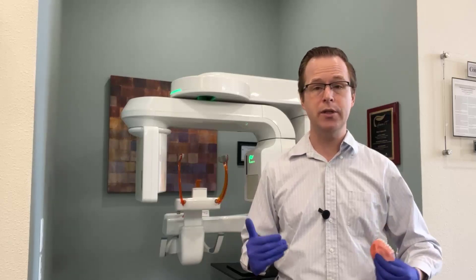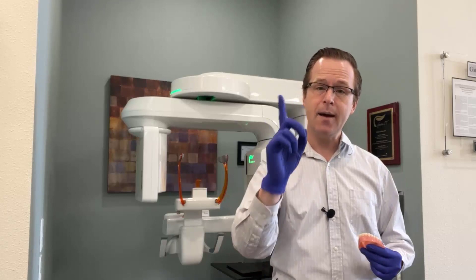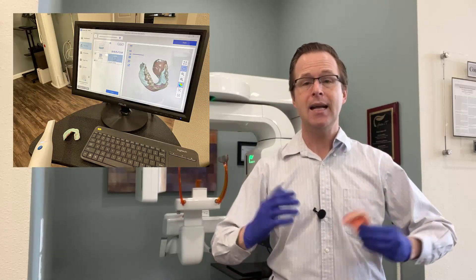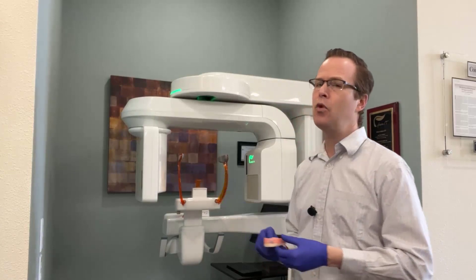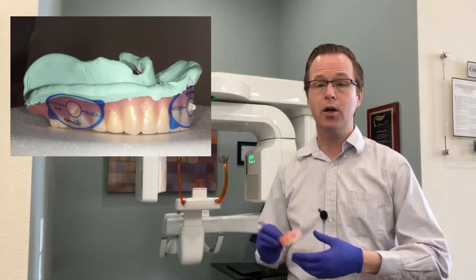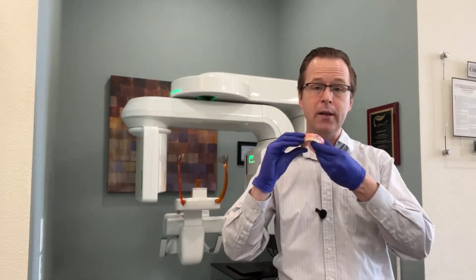If the patient moved during the scan, we may want to recreate it. You'll see double images or ghosting if the patient moves. We have to watch that because many of our overdenture patients tend to be older and have a little trouble standing still in the cone beam machine. Once we've captured scan number one — our cone beam scan of the patient wearing the prosthesis — we can remove the prosthesis, have the patient sit back, and make an optical scan of the denture. Optionally, you can also place the denture in the cone beam scanner propped on a foam plate. The required scans are a cone beam of the patient wearing the prosthesis and an intraoral or desktop optical scan of the prosthesis.